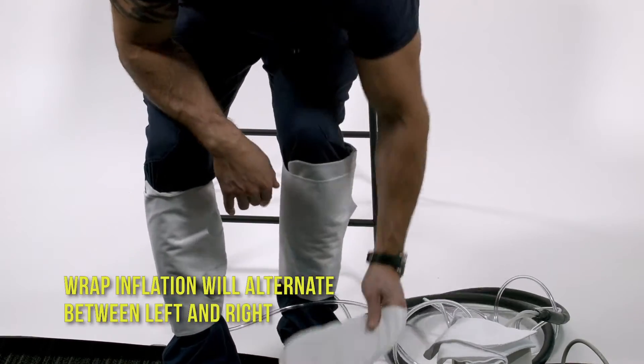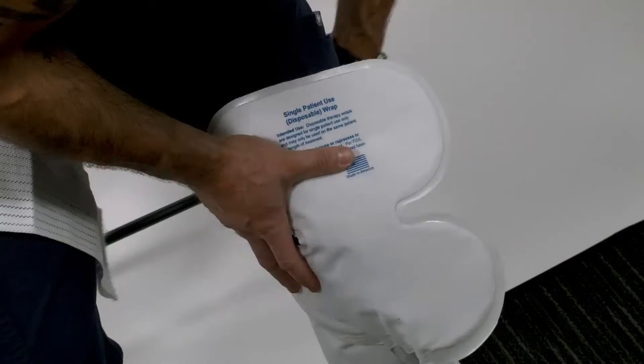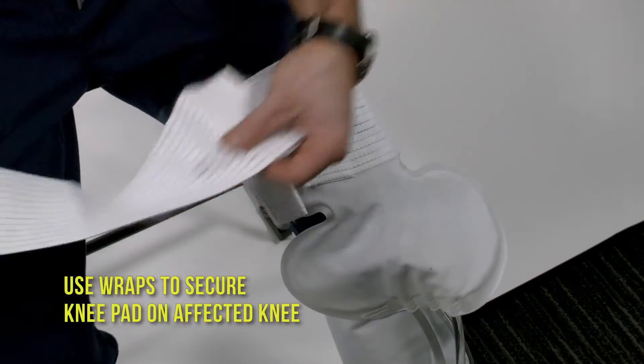Wrap inflation will alternate between the left and the right. Use wraps to secure the knee pad on the affected knee.